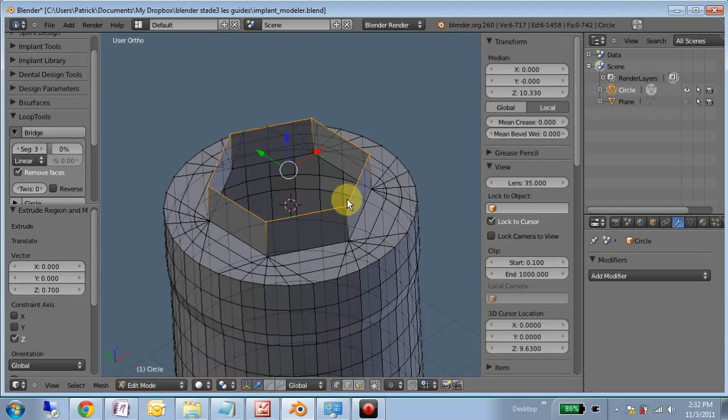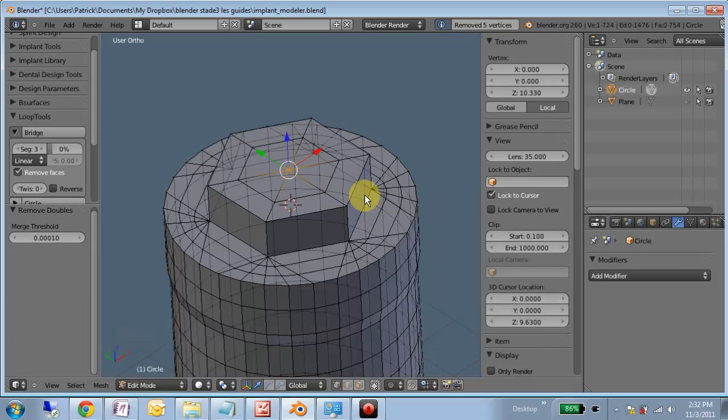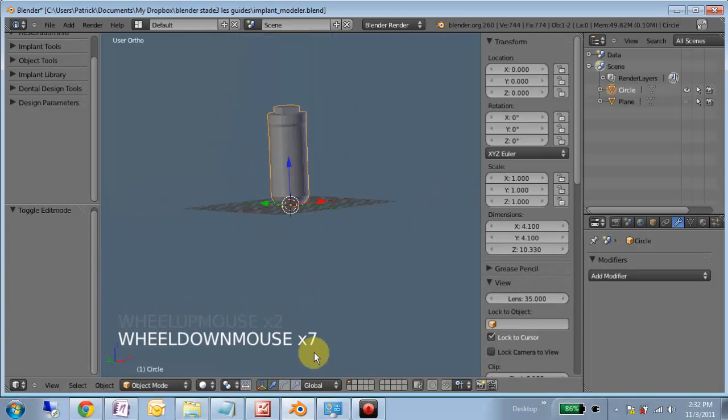We're going to use the same trick to fill this hole. Extrude, scale, some arbitrary amount, extrude, scale 0, remove the doubles, and there you have it. Here's a basic shell for our implant.